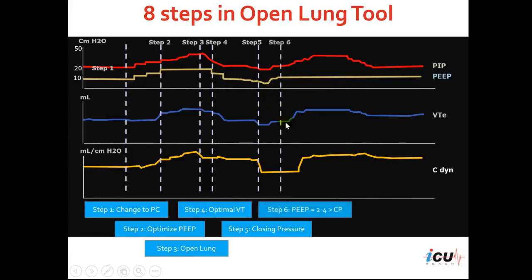The next step would be to set the optimal PEEP for the patient. We take the pressure defined as the closing pressure and add 2 to 4 centimeters of water above that closing pressure. That defines our optimal PEEP, so we increase the PEEP level again to the value of 2 to 4 centimeters of water above the closing pressure.